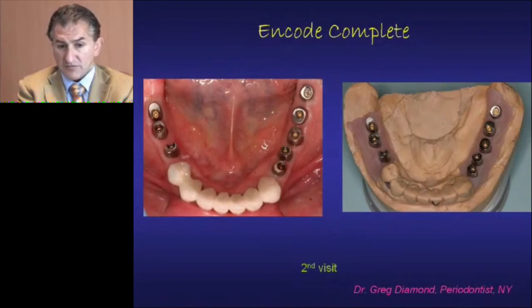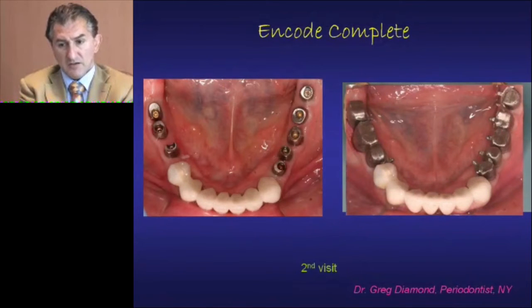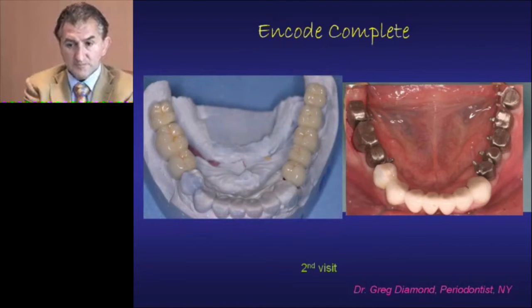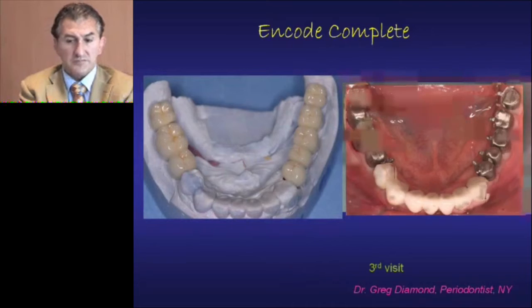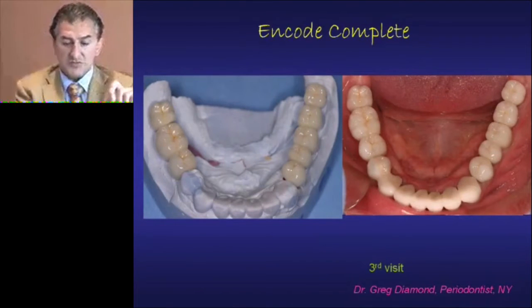Once the abutments are placed in the mouth, radiographs are taken. We go ahead and place the copings. We make sure that they fit in the proper position. Make sure they are down. X-ray radiograph is taken. A new impression is made at that point and a pickup impression. So the third visit, we can successfully deliver 8 units of implant restorations in a 3-visit protocol with good occlusal contact, good anatomy, and really a predictable, streamlined approach to implant dentistry. And that's really where the value is.